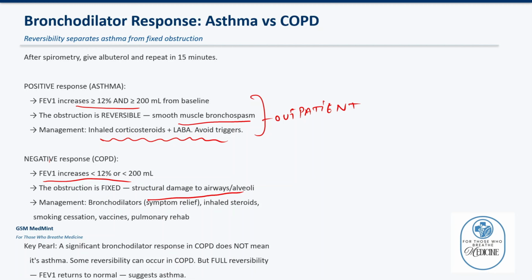A significant bronchodilator response in COPD does not mean that it is asthma. Some reversibility can occur in COPD, but full reversibility, where FEV1 returns to normal or near normal, suggests asthma. The degree of reversibility matters.